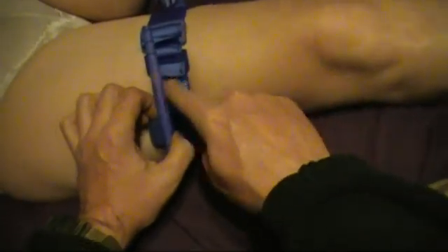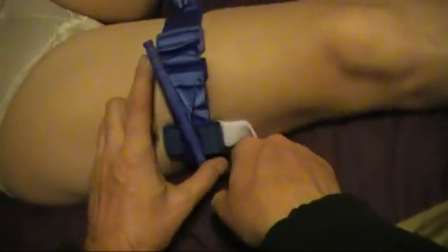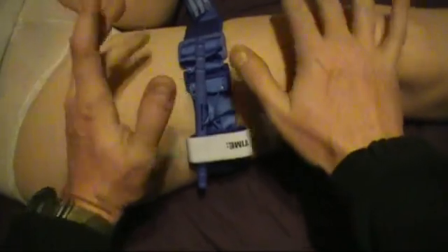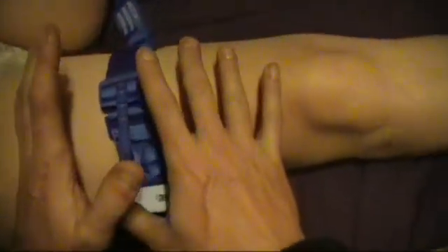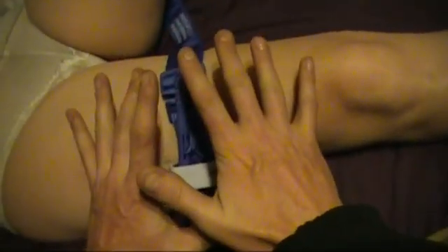Still bleeding, still tightening. Once you get it cranked down, it doesn't matter if you go left or right, that's why these are hooked in both directions: you take the windlass and you stuff it up underneath there, and you Velcro it in place. That's it, okay? Don't mess with it. If you have advanced medical training, there are some techniques of loosening it and trying to occlude it, but don't mess with it. As an average civilian, once you put this on, leave it alone, okay?